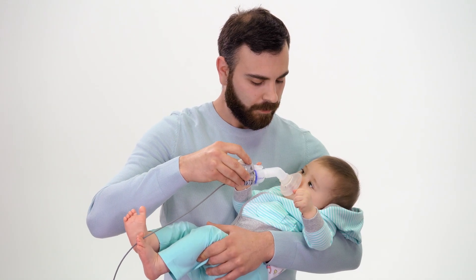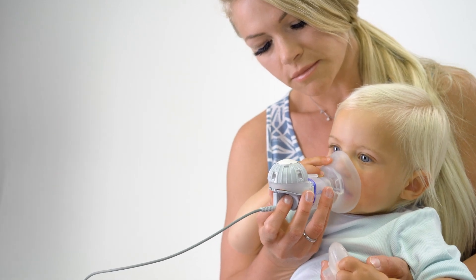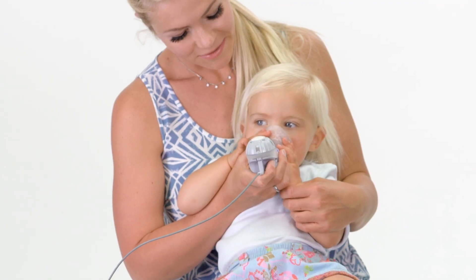If using a mask, place it over your mouth and nose, applying light pressure for a snug fit. Ensure that the nebulizer handset is horizontal.